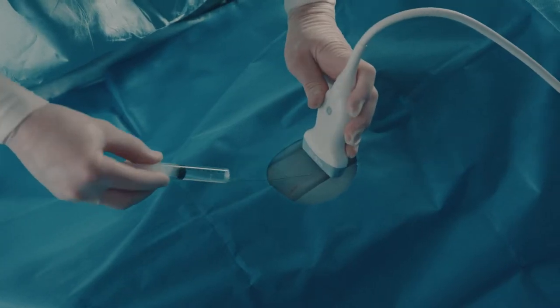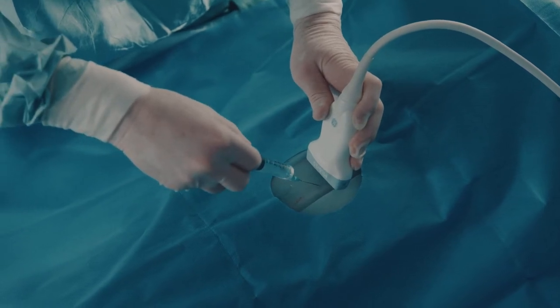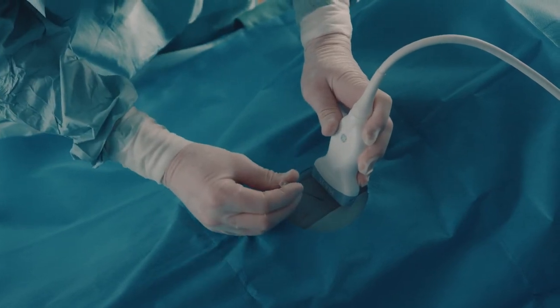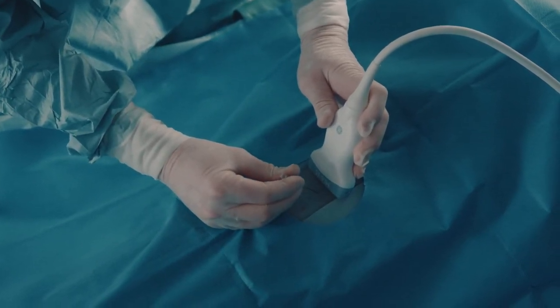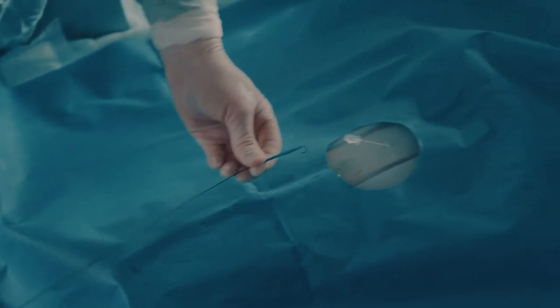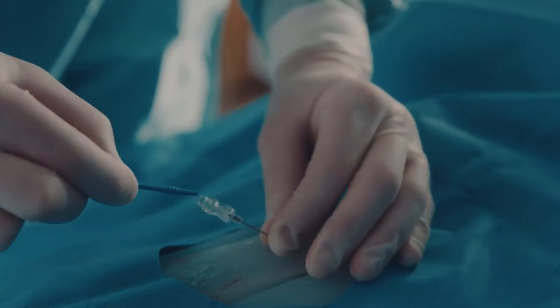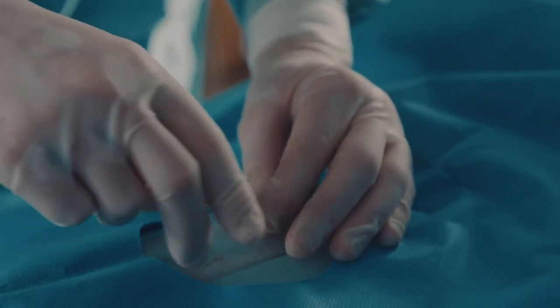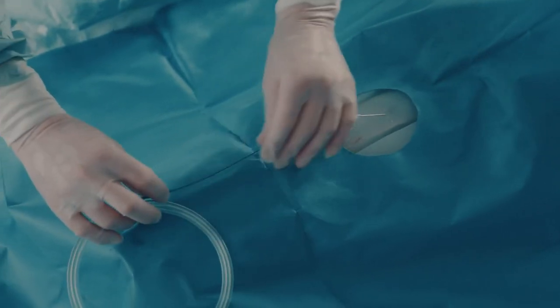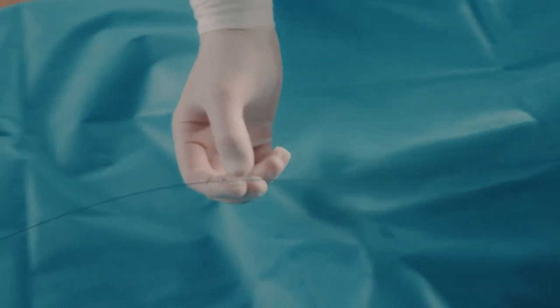Make sure to get safe access to the common femoral artery by the use of ultrasound guided puncture. Apply local anaesthetics if needed and if there is time. The rest of the procedure is performed using standard Seldinger technique. Once the 19 gauge needle is in the artery, insert the guide wire with the soft J-curved tip into the needle. Advance the guide wire approximately 50cm. If resistance is felt, stop and retract the guide wire. Retract the needle keeping the guide wire in place.